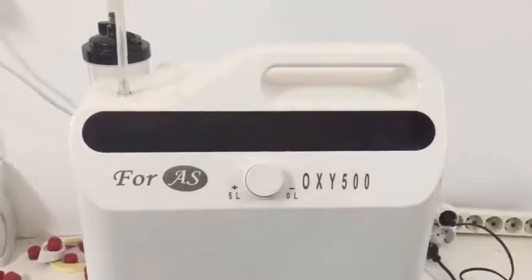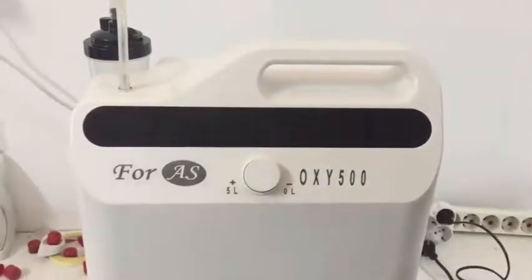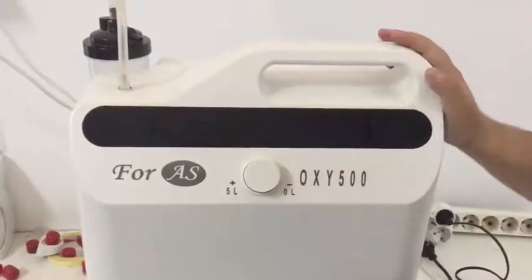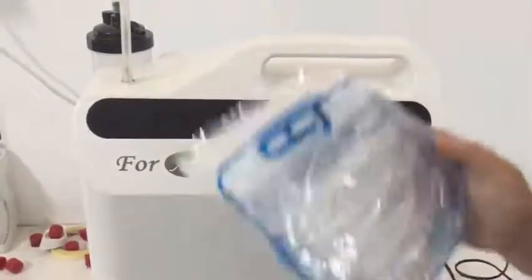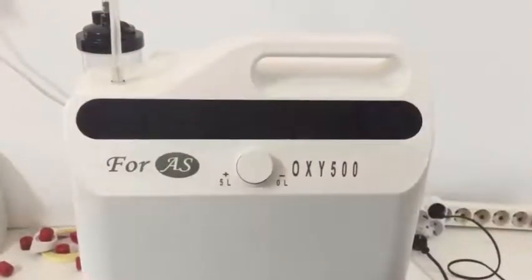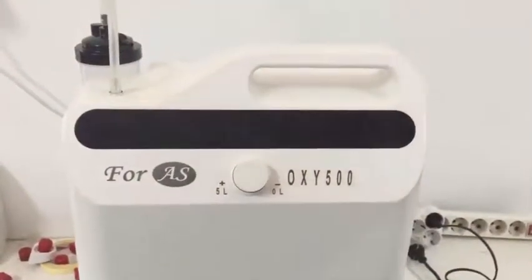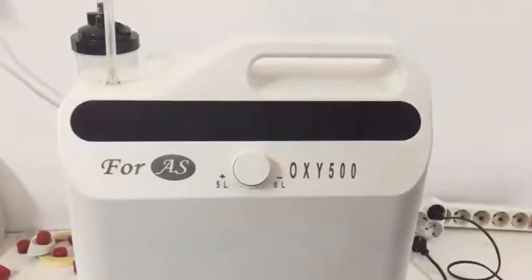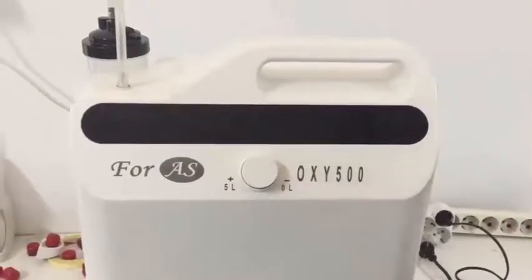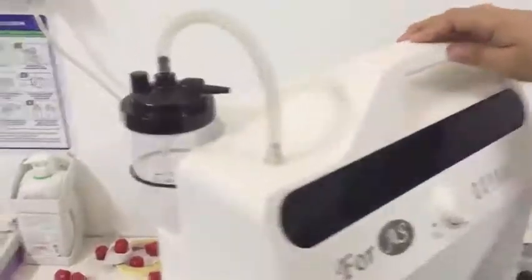Hello. In this video we are going to introduce you to the Oxy 500 oxygen concentrator. In the box of the ordered oxygen concentrator there must be one oxygen concentrator, one patient cannula, and the water box. Be sure that these three units exist in the box before you operate the oxygen concentrator.